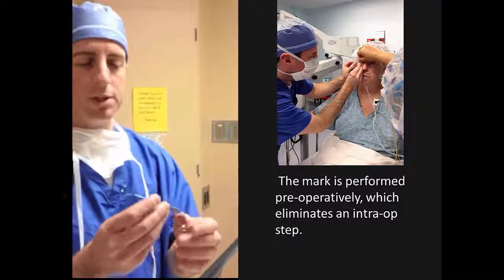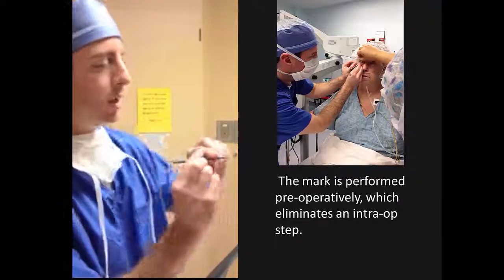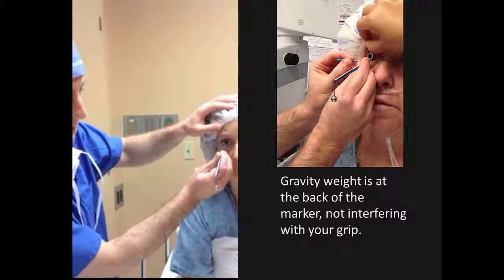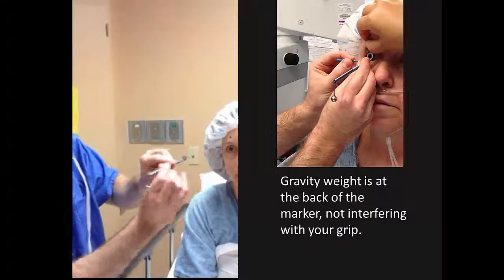There are a couple of modifications to this particular one. The first is that the weight is in the back, so you can put your fingers pretty close — if you want to be steady — or if you're more comfortable holding it further back, you still don't hit the weight. That's the first thing.